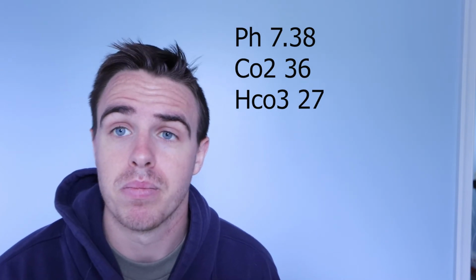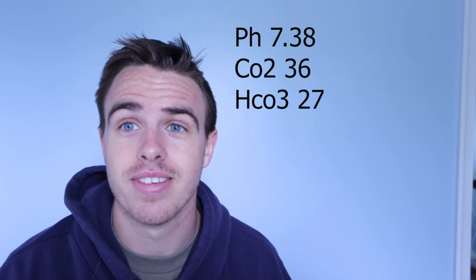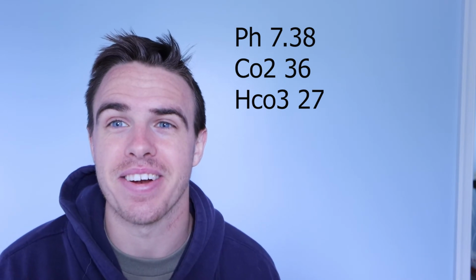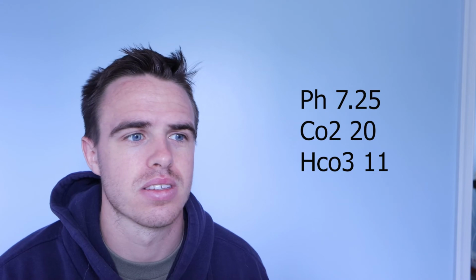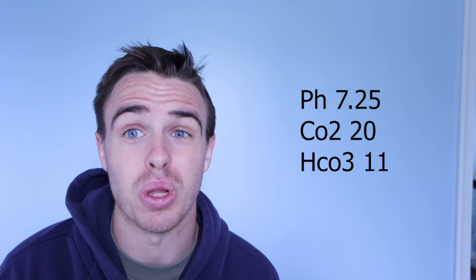Okay, pH looks good, CO2 looks good, bicarb looks good. We got normal ABG. Alright, let's try another. Okay, the CO2 is low. Okay, the pH is low, CO2 is low, and bicarb is low.